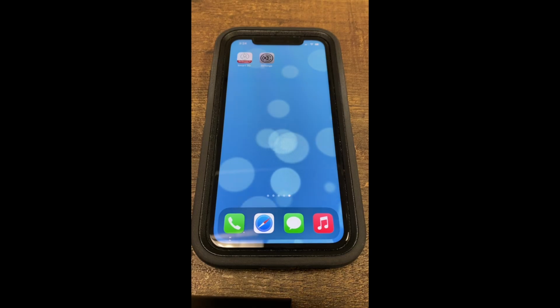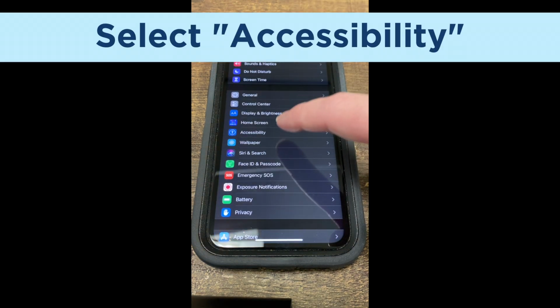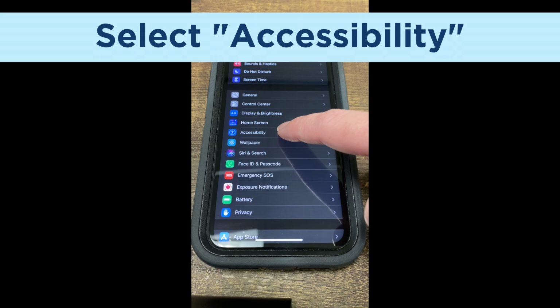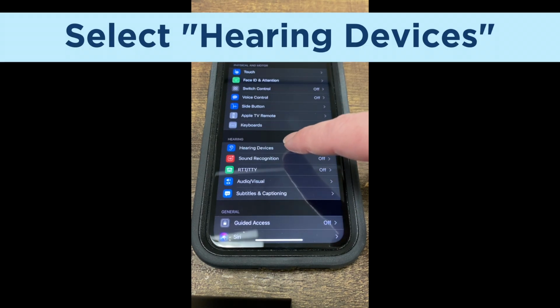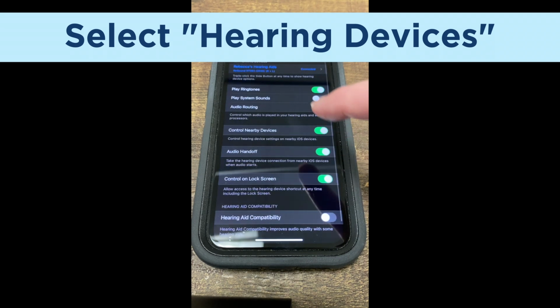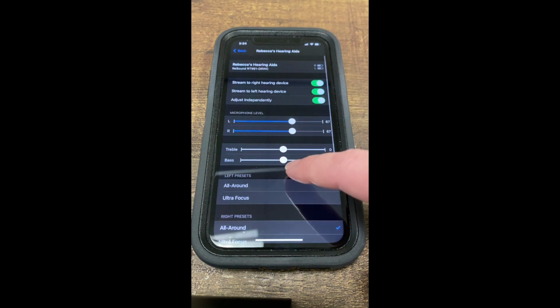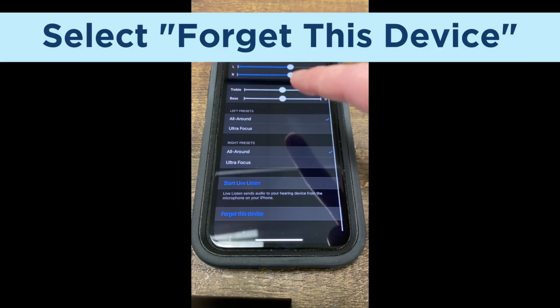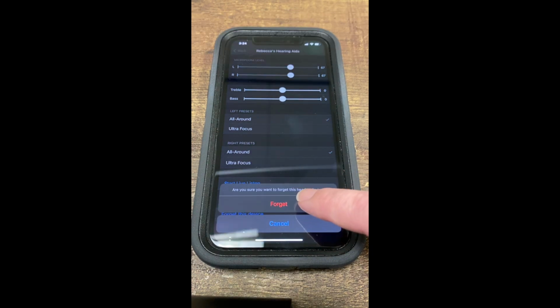So the first thing you'll want to do is go ahead and unpair your hearing aids from your phone. You'll go into the Settings app, scroll down to where it says Accessibility, scroll down to where it says Hearing Devices. Then you'll see your name, so you'll go ahead and click on your name, and then you'll scroll to the very bottom where it says Forget this device. Go ahead and click on Forget.